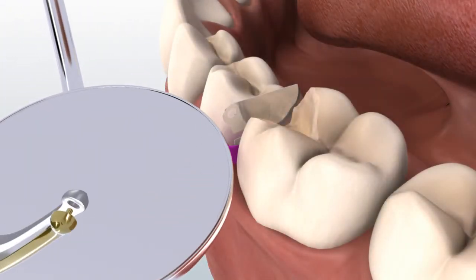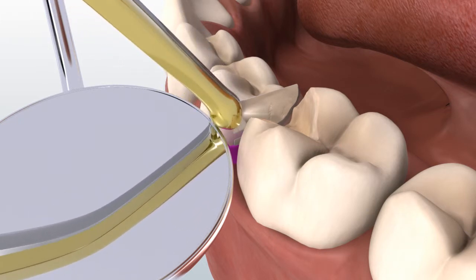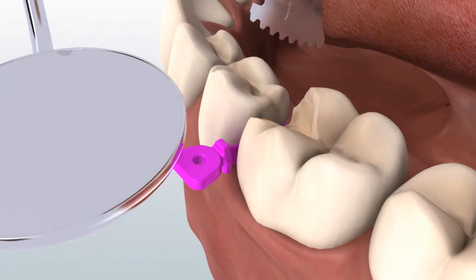After completing the prep, detach the guard from the wedge. You need to hold the wedge part down while pulling up on the guard. You are now left with a wave wedge in place.